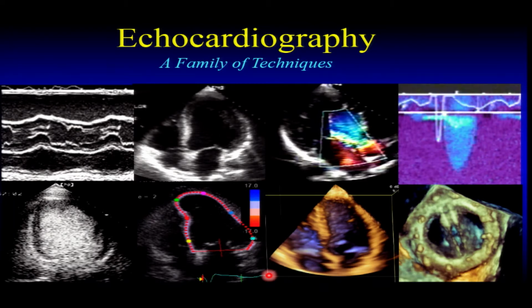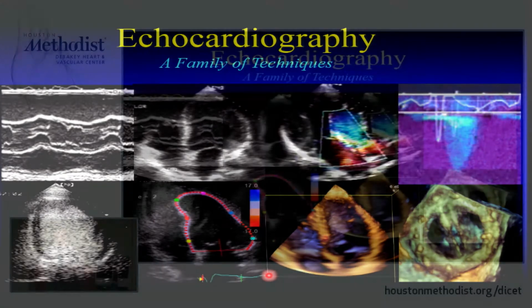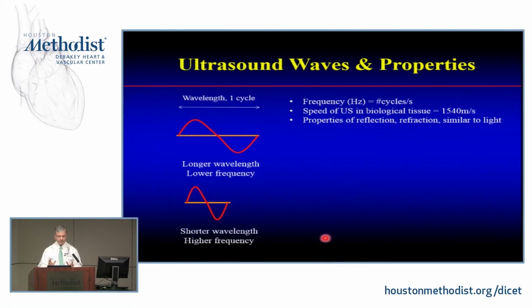And the amazing thing to me is that all this evolution in ultrasound is still under the same premise. It's really the same premise, which is I send a wave and it is in the ultrasound frequency, so you and I don't hear it. It's not in kilohertz, it's in megahertz. So that this wavelength that you see on the left is very, very small.